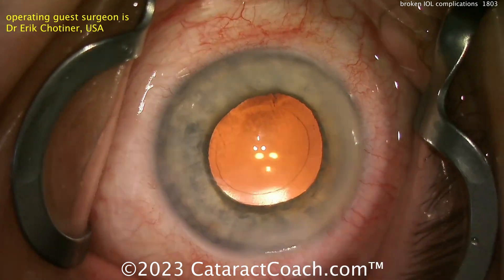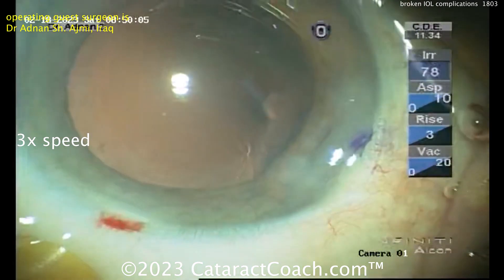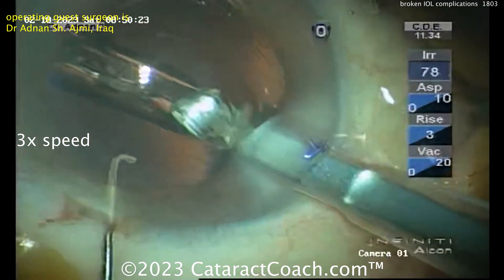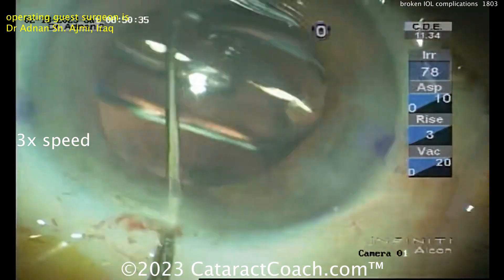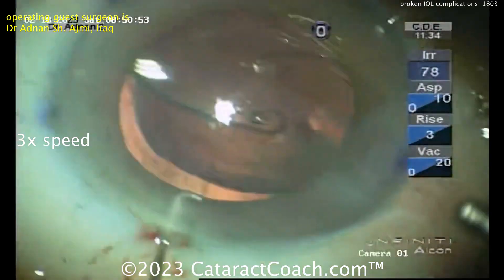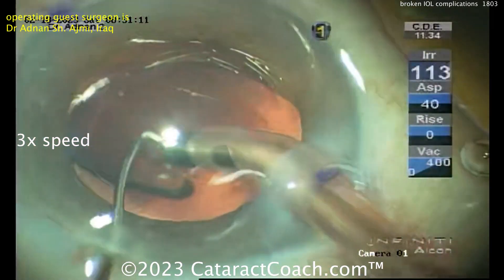Let's look at another case — this one is really unusual. Not high-resolution video, I know, but forgive me; these are cases that need to be shown. A routine case, capsular bag is there, putting in viscoelastic and delivering the lens. Watch carefully as the lens goes in the capsular bag. Open up the haptics — so far it looks pretty good. Just give it some time. Put the IA probe in the eye, get those haptics to open up. Watch carefully — what do you notice?